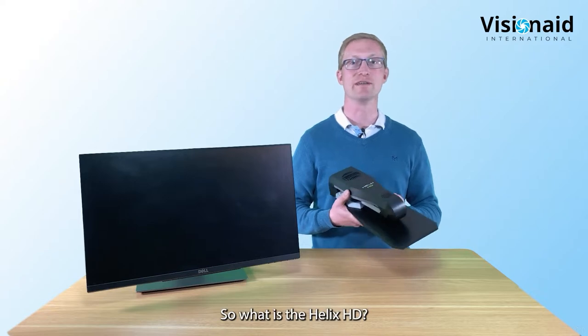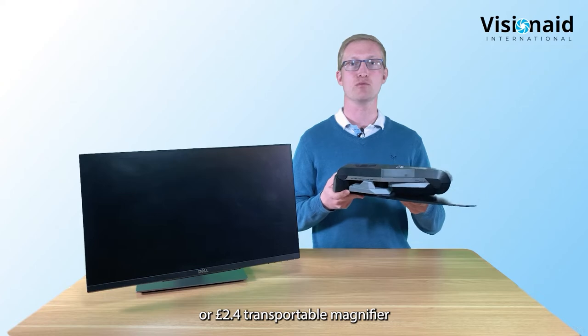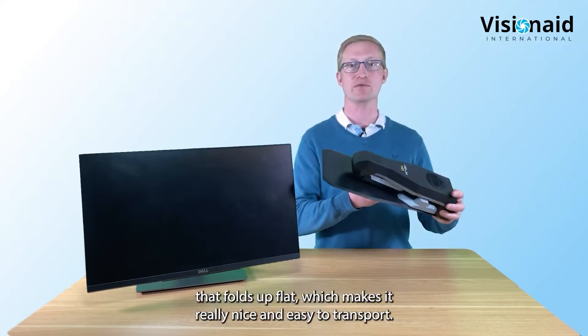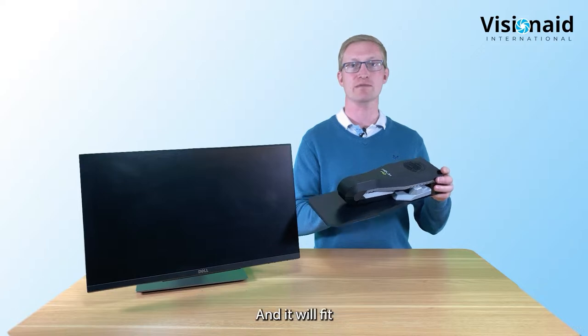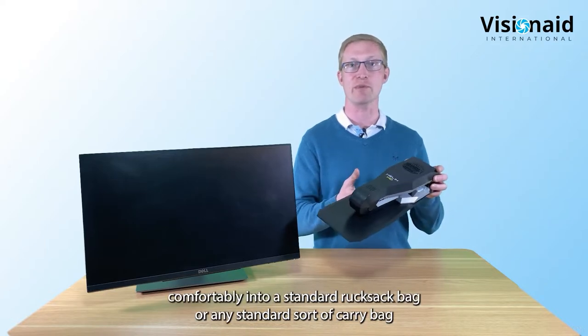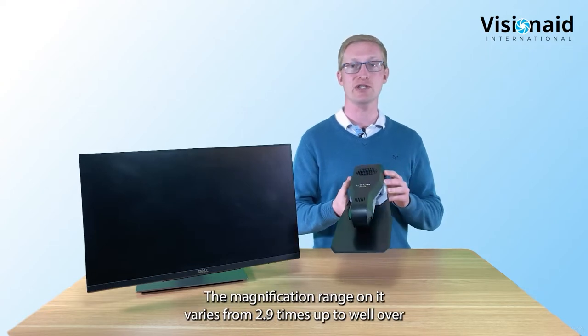So what is the Helix HD? It's a really lightweight 1.1 kilograms or 2.4 pounds transportable magnifier that folds up flat, which makes it really nice and easy to transport. It will fit comfortably into a standard rucksack or any standard carry bag if you need to move it to multiple locations.